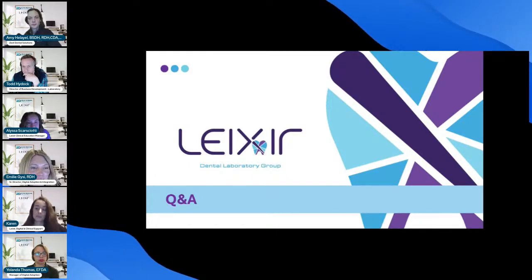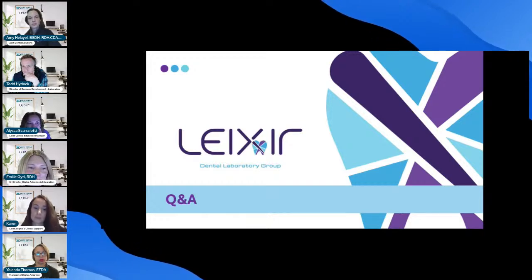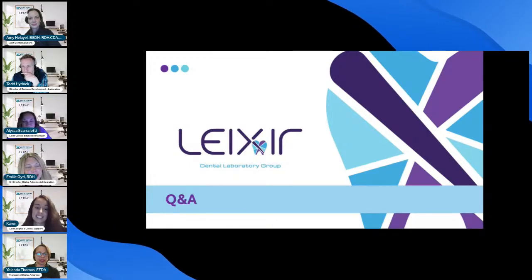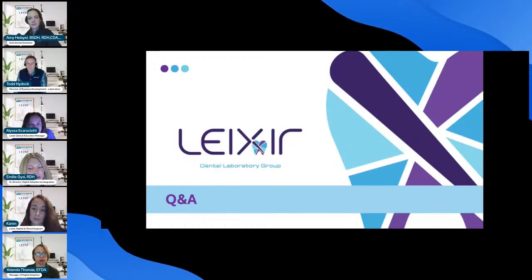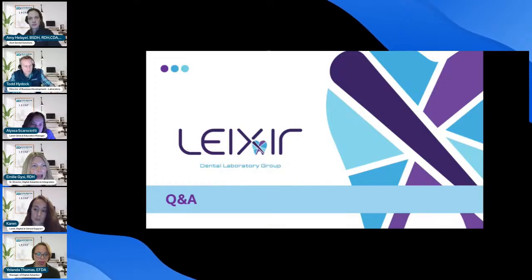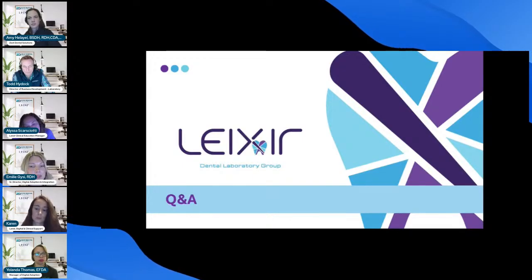There's a lot less frustration with edentulous tissue now with a lot of the scanners. I do agree, Karen, the Lumina is pretty impressive and fast with scans now. It's pretty awesome. But there are so many scanners that do a really good job. And I think the key too is following a scan path or scan strategy when you're scanning edentulous tissues, or if they have an existing denture you're trying to scan extraorally, and 360.